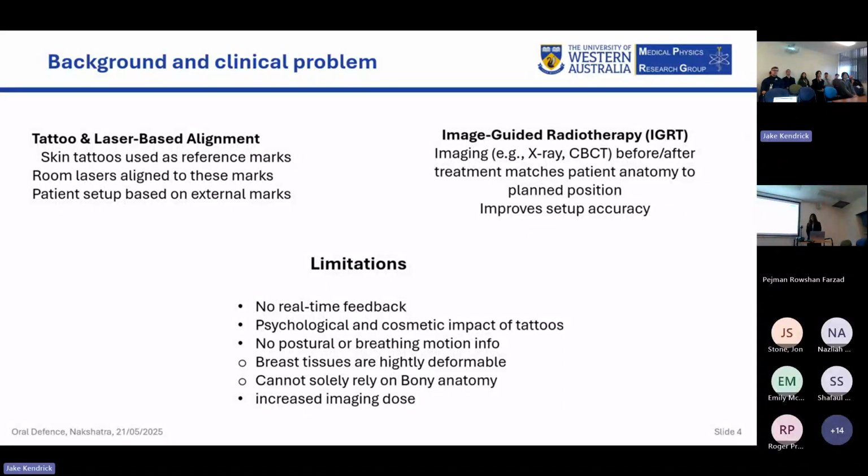However, both methods have important limitations. They don't provide real-time feedback, which means patient motion during the treatment, especially from breathing or posture changes, isn't accounted for. And also, tattoos, while helpful, can have a lot of psychological and cosmetic impact, as the cancer treatment journey can be quite distressful for the patient, and they would like to not have a permanent and visual reminder of that.